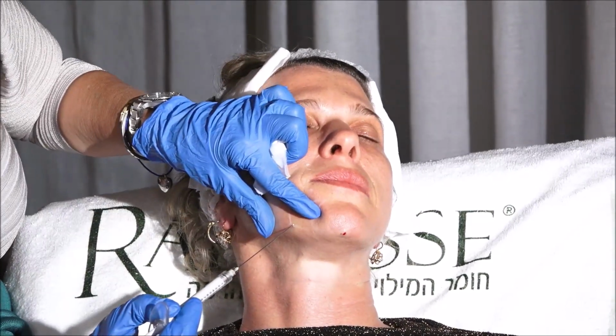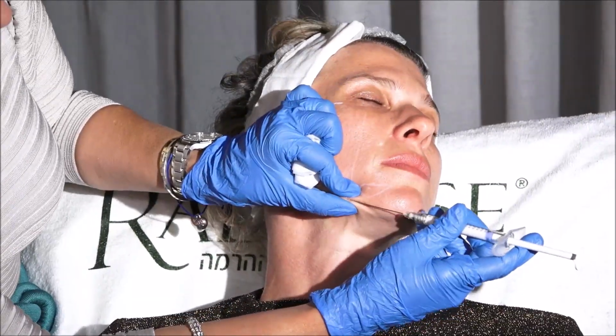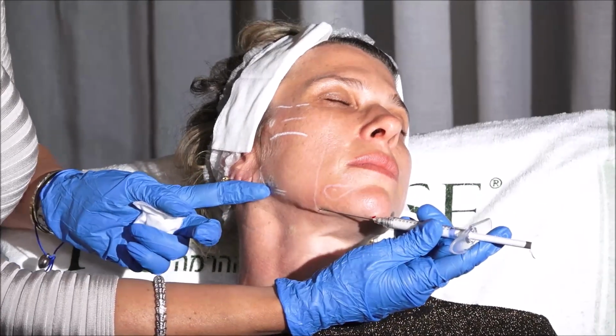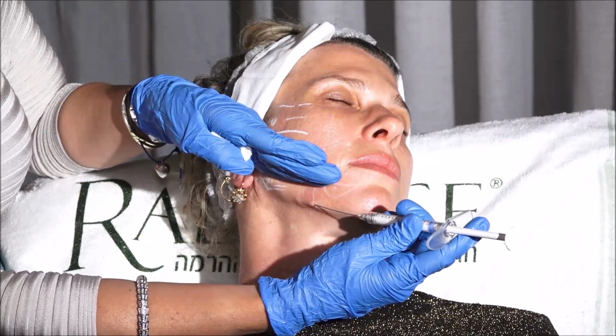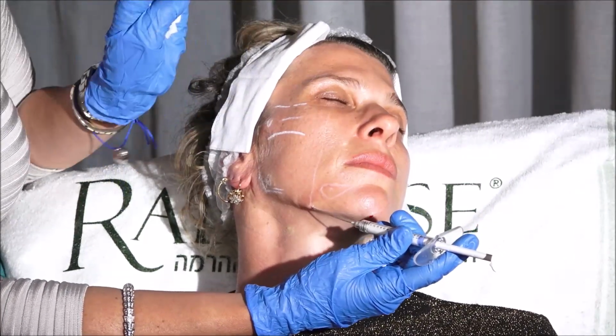So I start superficial. Okay, lower border. This is important. Lower border, not lateral. Otherwise, I'm going to widen the face. She has a beautiful proportion in the face. I don't want to mess with that.